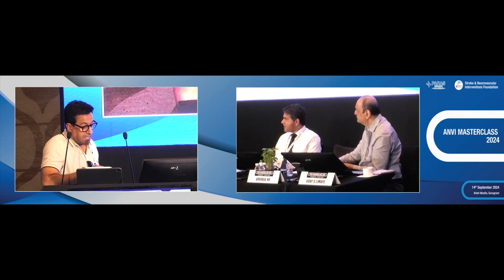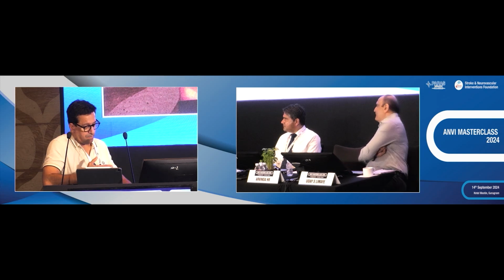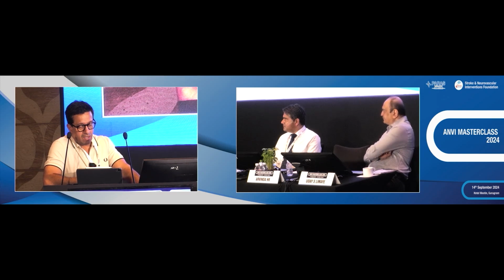Yeah, there is a learning curve with everything. What you're describing, I have been always lucky to start early, so I have more screw-ups than many people. And I totally get what you're saying. If it's undersized, you're going to get into trouble. Now we know that a 9 millimeter Contour is a problem, but we've been through that learning curve for WEB also. I started WEB in 2012, 12 years ago. So I know now when not to use WEB, and I know now when not to use Contour or how to use it.